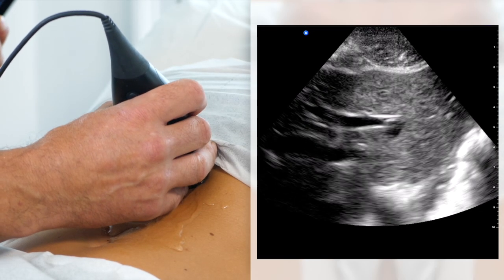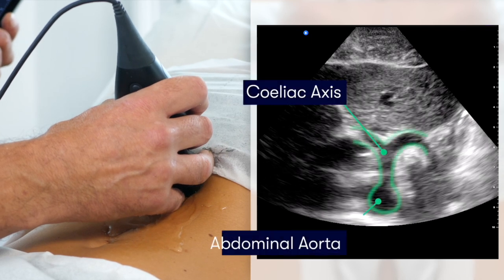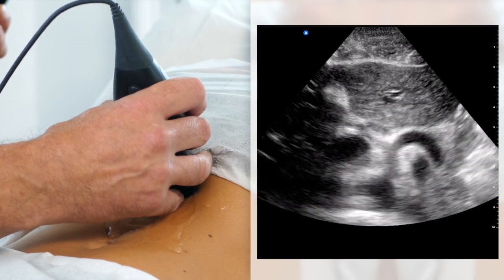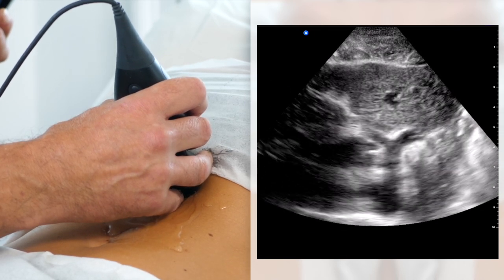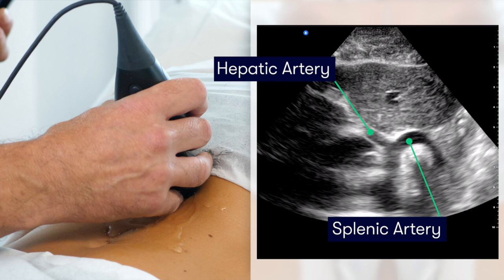Deep to the liver, we can now see the celiac trunk, or the celiac axis. The Y-shaped blood vessel which we can see here is the celiac trunk as it comes off the abdominal aorta on the patient's left side. Looking at the patient's left, we can see the splenic artery, and on the right side, we can see the hepatic artery.